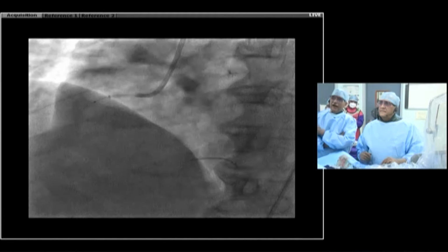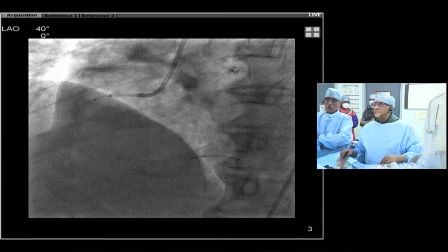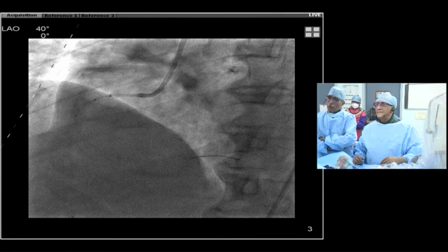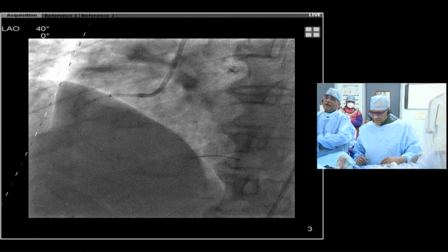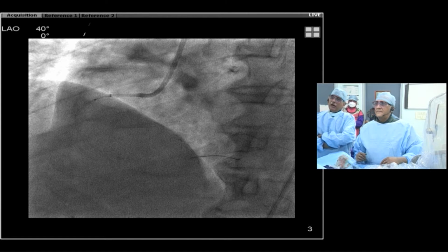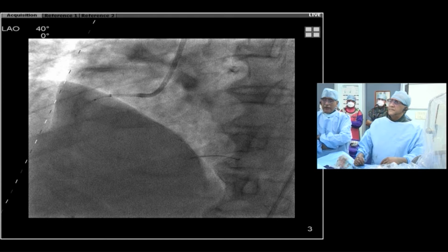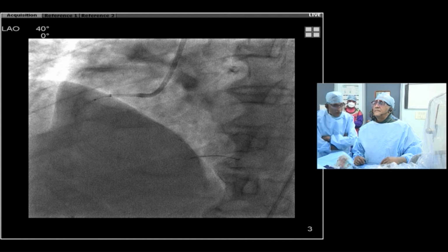We had a little bit of discussion. I felt that we should use an XTR, and Kirti walked in through with a microcatheter and a run-through wire, then placed a Guidezilla for coaxiality, and now we have a 0.9 fiber laser right there. Over to you, Kirti.